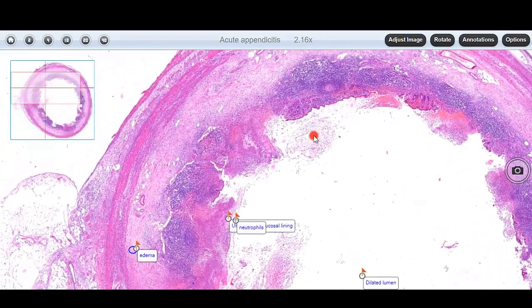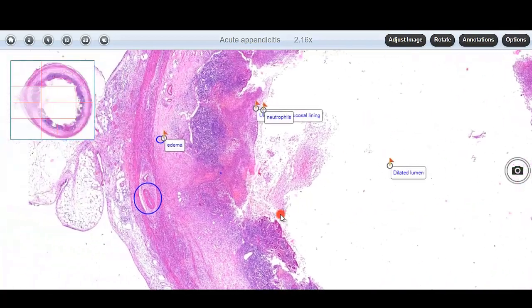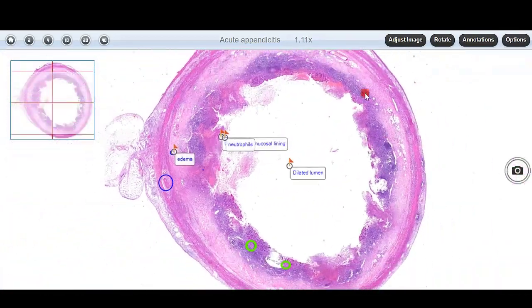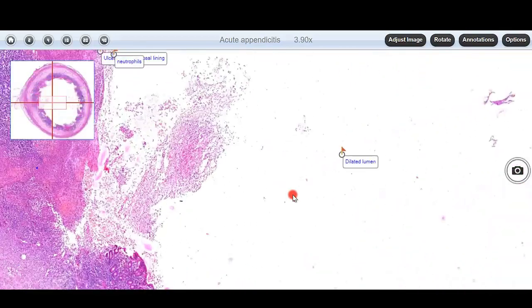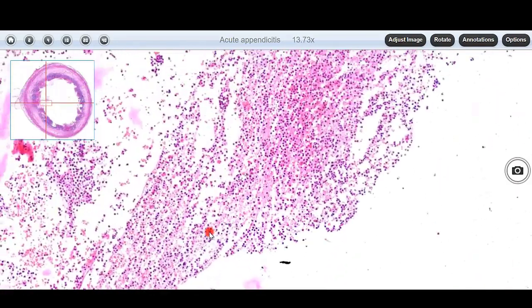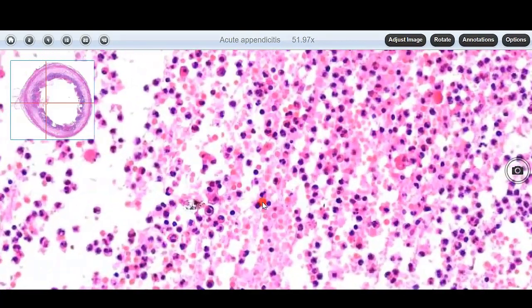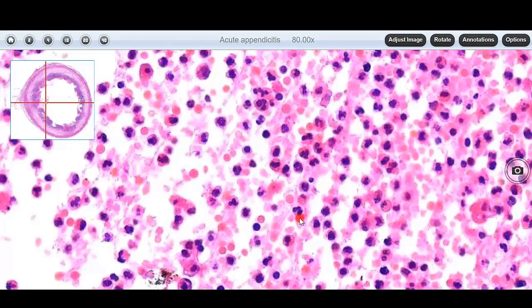Now we come to the histopathology of acute appendicitis. Here we can see that the lumen is markedly dilated compared to the previous slide. We can also see inflammatory infiltrate coming into the lumen, and this inflammatory infiltrate comprises mainly of neutrophils.